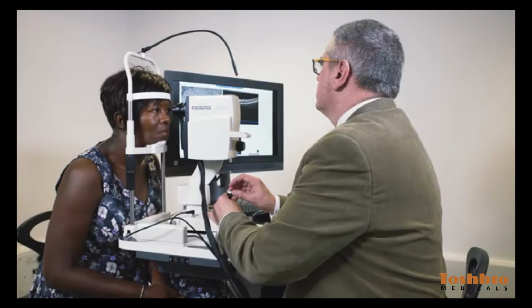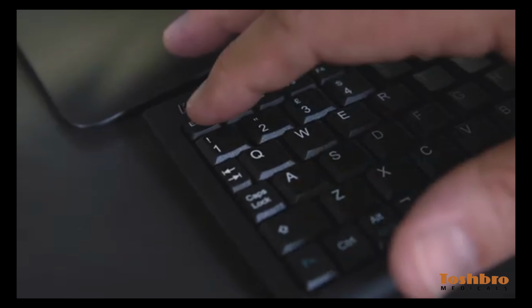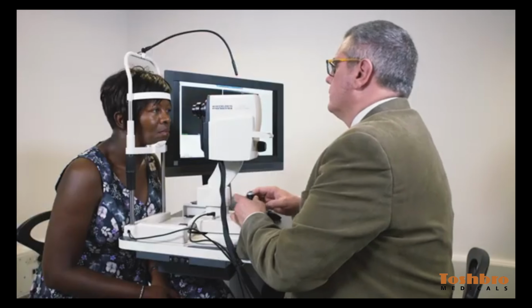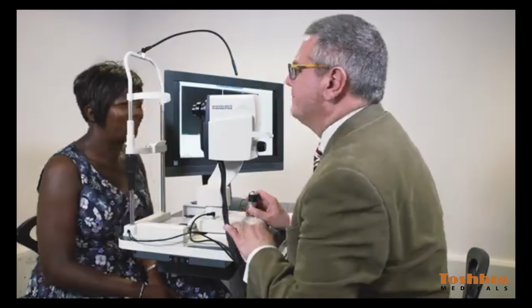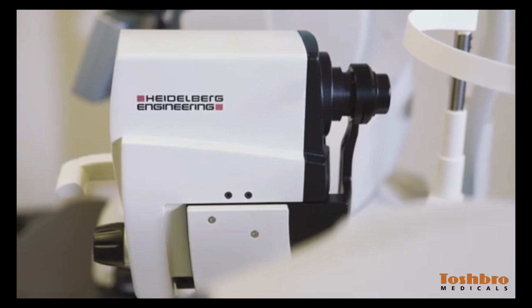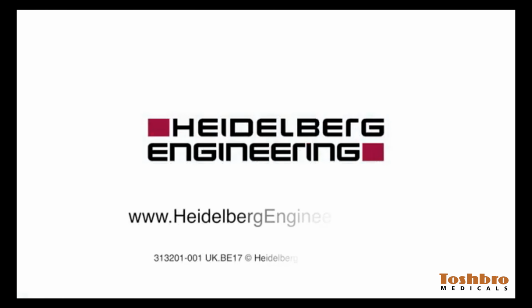Move the camera head to the fellow eye and immediately repeat the procedure. Press Escape and continue to the retina examination. Acquire the images as previously instructed. For further information on acquiring images or using the Heidelberg Eye Explorer software, please refer to your SPIRIT user guide.